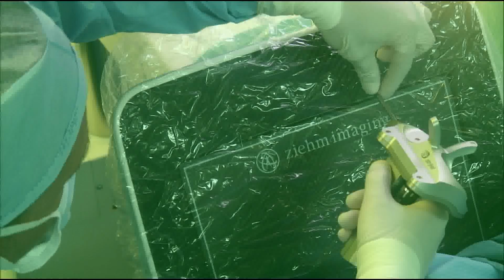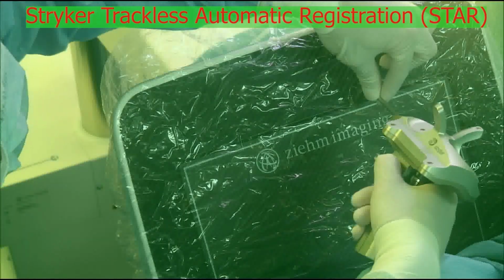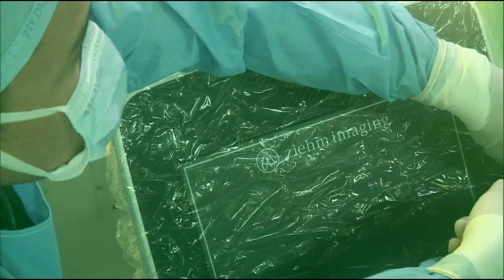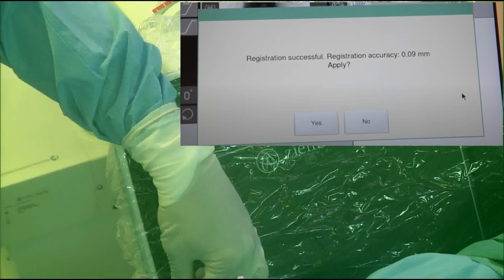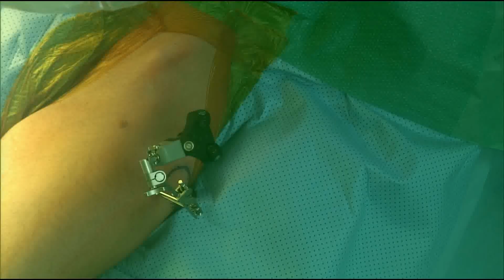Then after that, we start the registration of the patient, and here we used the Stryker trackerless automatic registration. Here there are three dimples on the Ziehm machine or the 3D scanner, which we identify to the system. The system should register an accuracy of less than 2mm. In this case, we get an accuracy of 0.09mm, which is good enough.